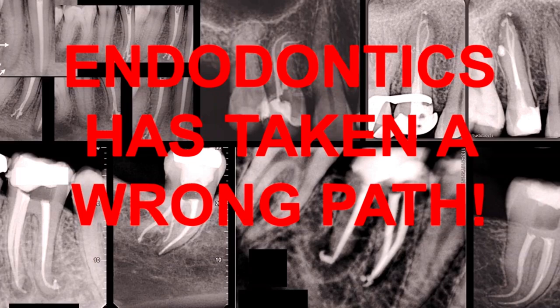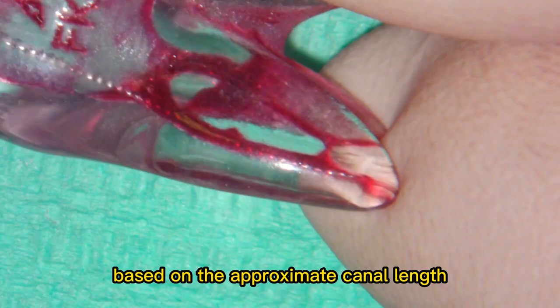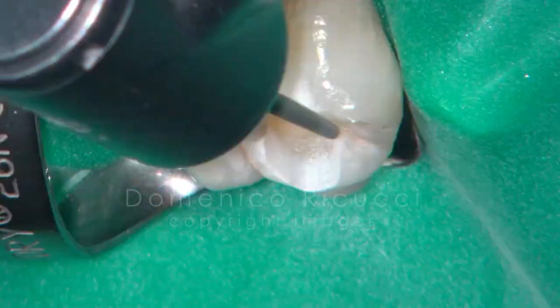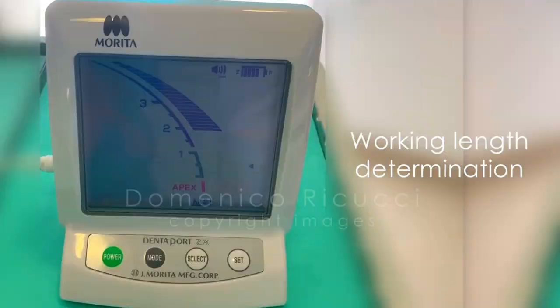Based on the approximate canal length measured on the diagnostic radiograph, explore the canals using 08, 10, and file. Prepare stable reference points. Establish working length at the apical constriction at the end of the blue scale if you use the Morita device.